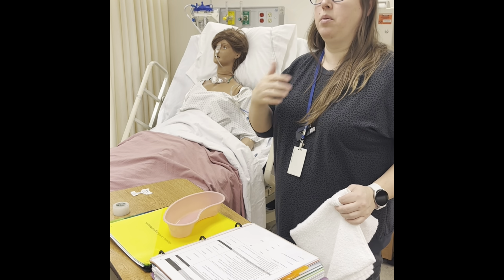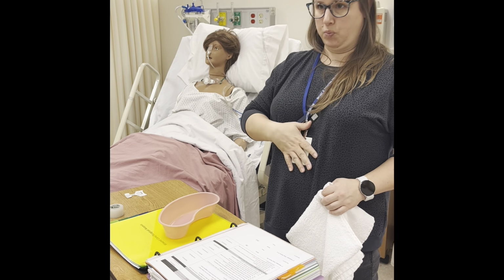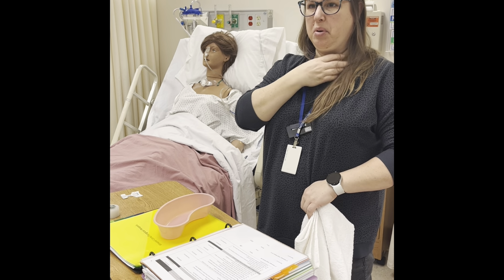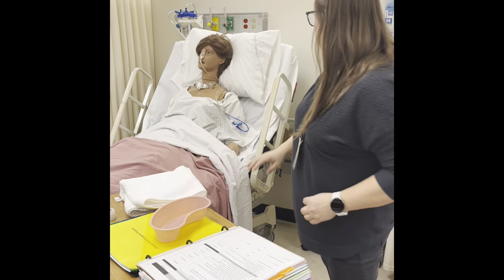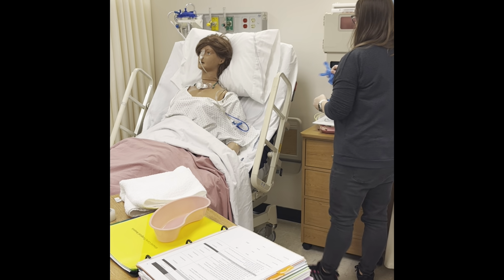The big thing, tell them they may feel some discomfort. That tube is coming up, it has stomach acid on it, so they may feel some heartburn or stuff in the back of their throat, or in their nose when it's coming out. We're gonna perform hand hygiene and put on our gloves. Again, just another set of gloves.